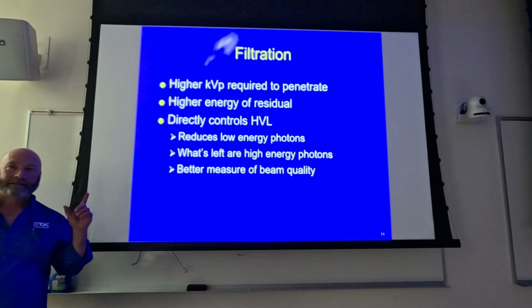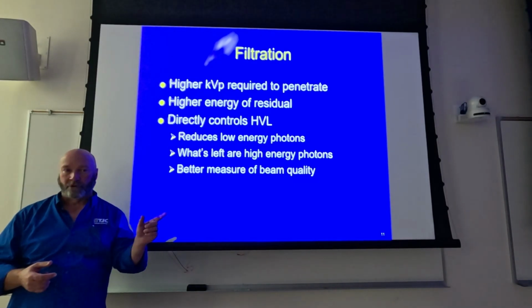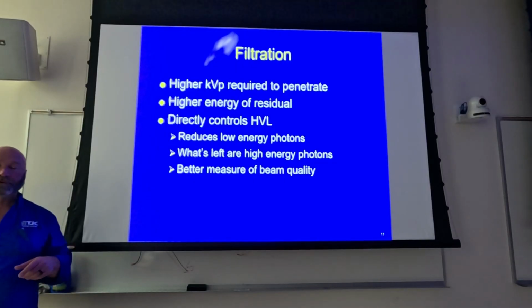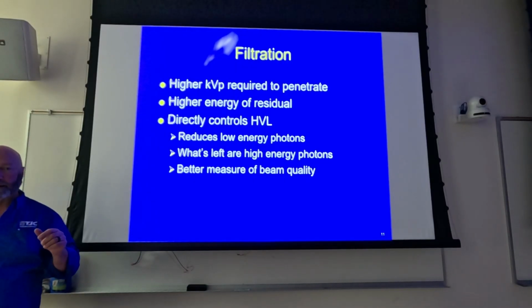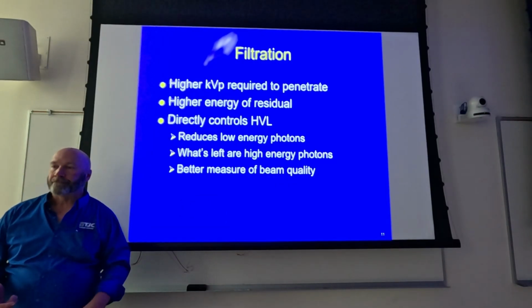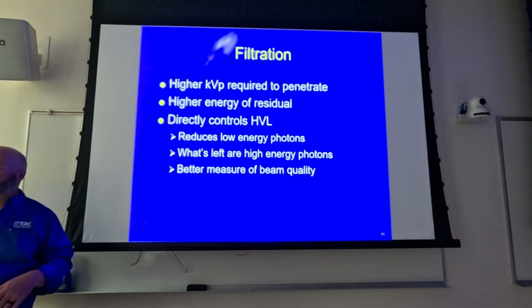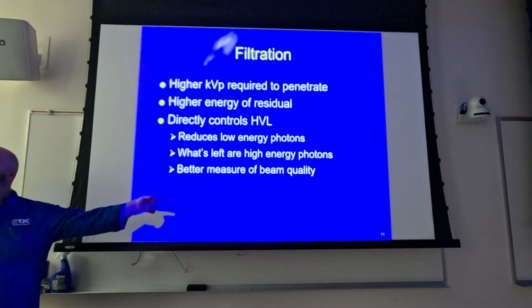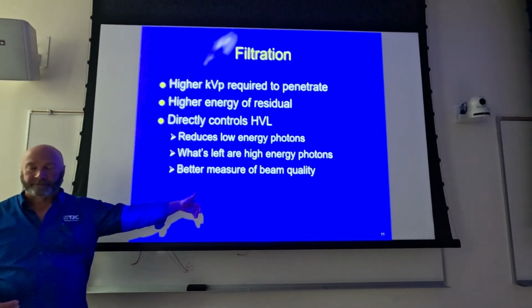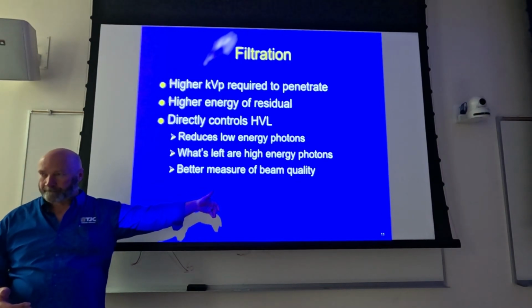But what you have set on your control panel has to match what that detector reads. So they're going to have to go into the system and adjust it and tweak it a little bit so the output from the X-ray tube reads 100 mAs. Thinking back at our drawing of filtration, we've got the same output, but what happened to our average energy? Push it to the high energy side, right? So we've still got 100 mAs, it's just a better quality X-ray beam, right?